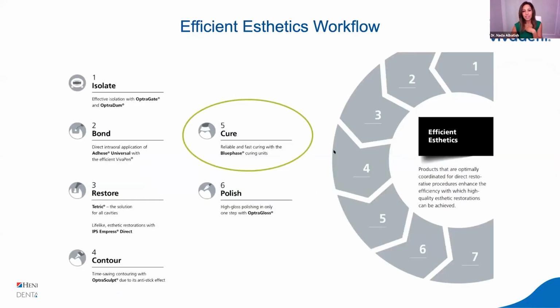And curing might seem like it's really simple, and you can probably do a half day or full day lecture on curing all by itself, because it is one of the most important steps in your composite restoration, because a bad cure will compromise the integrity of your entire restoration. And the first step in curing really well is using a really high quality curing light.